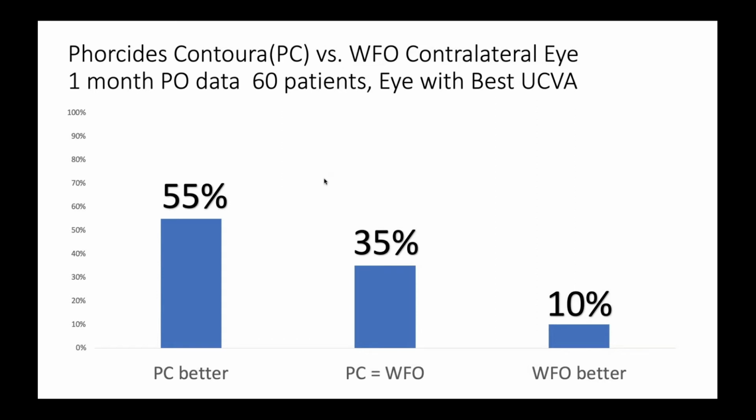Why go through all this effort of learning how to use Contura, learning how to use Phorcides? Wavefront optimized was really good. It's easy to do, so why make that switch? Before I rolled Phorcides out to other surgeons, I had to prove to myself that it was safe and that it was better than wavefront optimized.